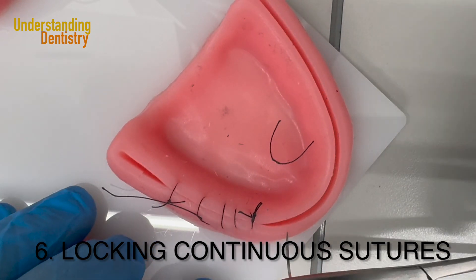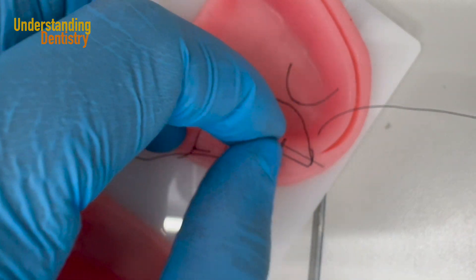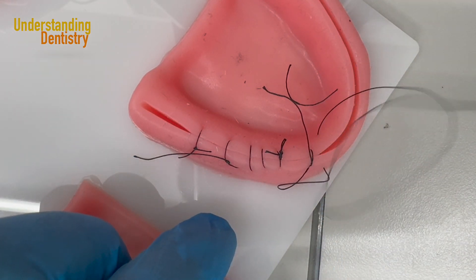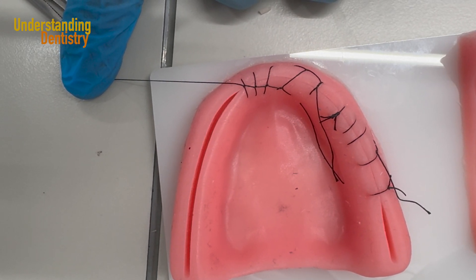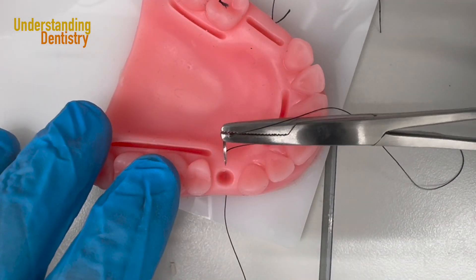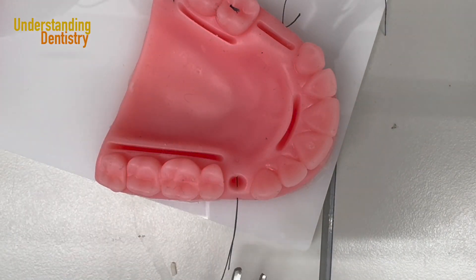For the locking continuous suture, I first do the single suture. Then when I keep going buccal to lingual in the mesial or distal direction, it's a little different: I have the looping and I want to pass my needle inside the loop first. So I pass my needle inside the loop and then continue the procedure — this is the pattern for the locking continuous suture. For the vertical mattress suture, you start deep buccal, then come back more superficial from lingual to buccal — two different heights.